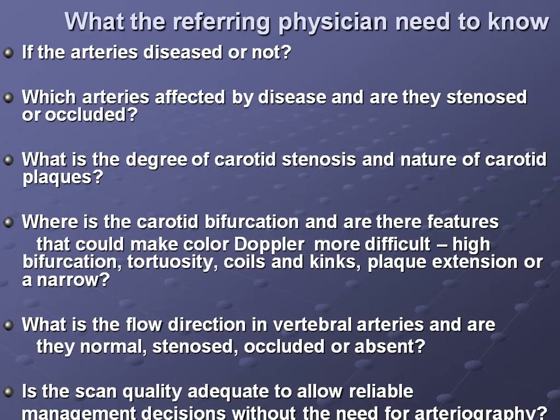What is the flow direction in the vertebral arteries? Are they normal, stenosed, occluded, absent? Okay. Is the scan quality adequate to allow reliable management decisions without the need for arteriography? You should tell him: further evaluation by conventional catheterization is recommended. Further evaluation by CT angio is recommended. Further evaluation by MR angio is recommended. No need for further evaluation.